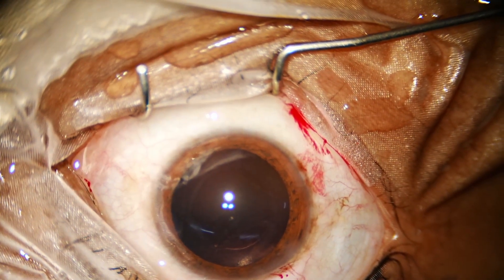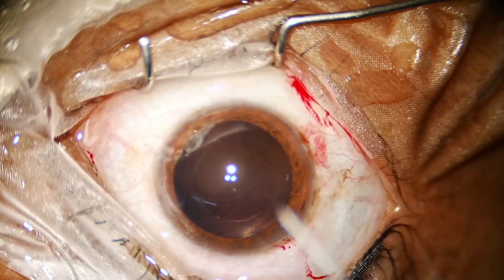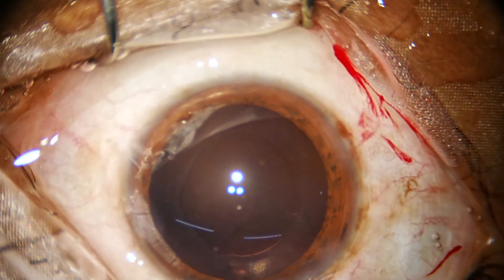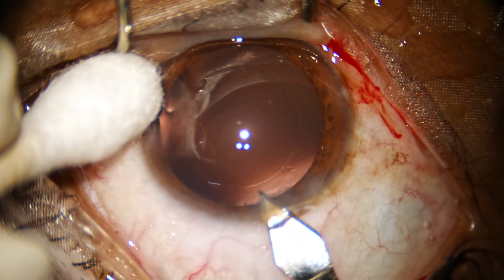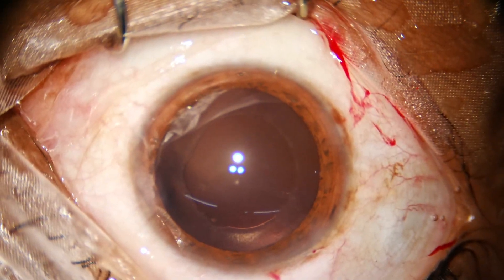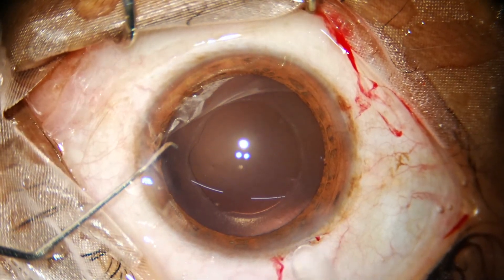The haptic is folded and going forward. We need to enlarge the main wound by 0.2 millimeters. Now replace it.